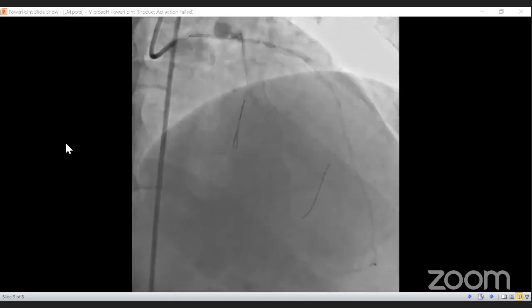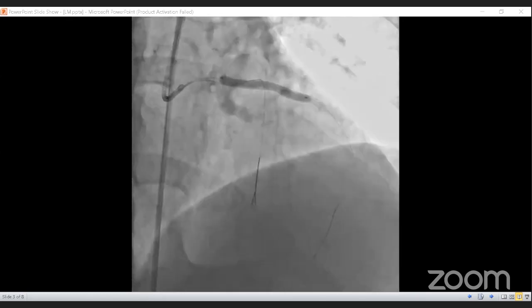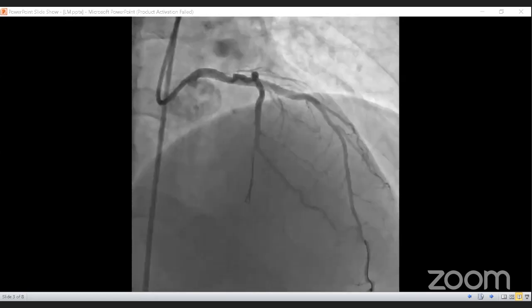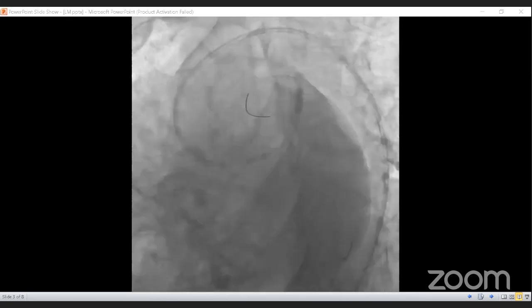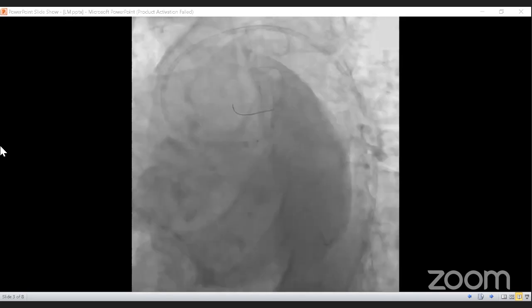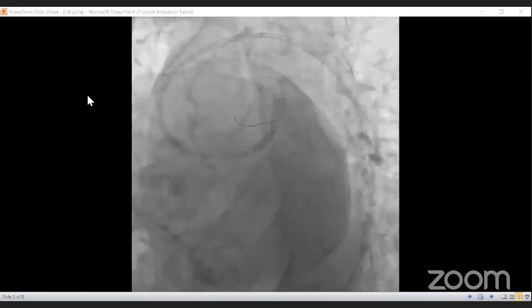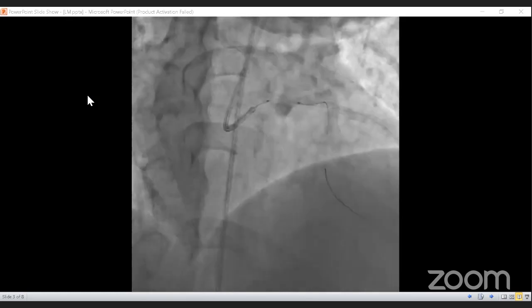So if I see a pinch, maybe I would go with a 2 mm balloon just to open this flow for any future intervention, but I would not go for a one-to-one balloon, and I would not go for a kissing balloon unless I do a two-stent strategy. This is my opinion. It's not mandatory for anyone, but it's a collection of many opinions.